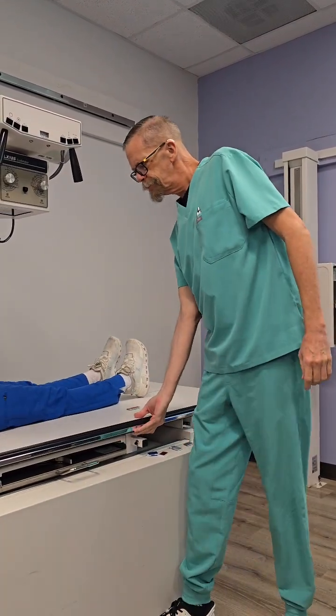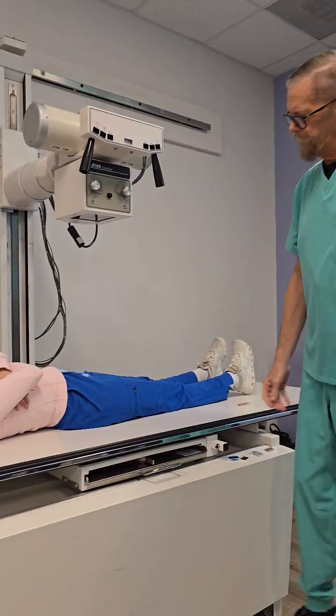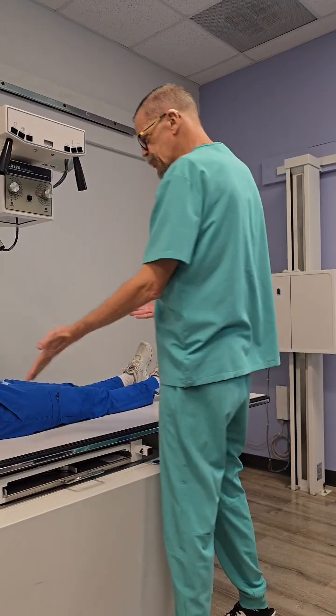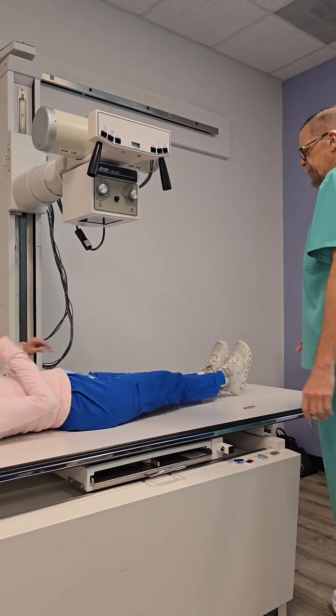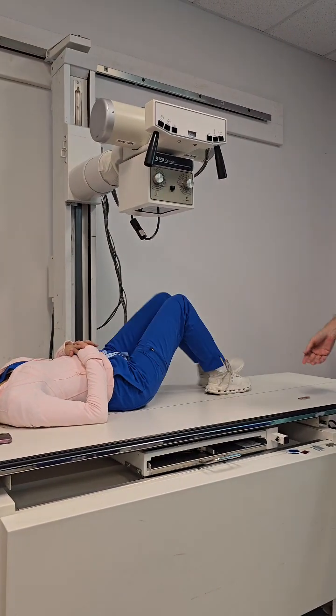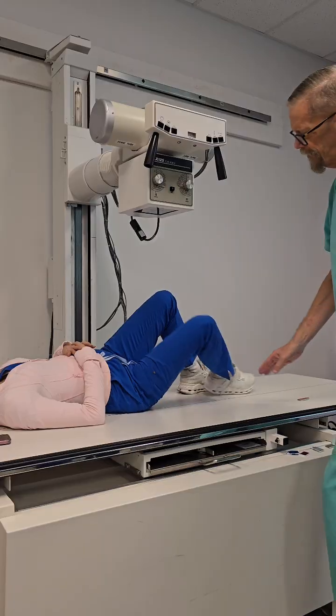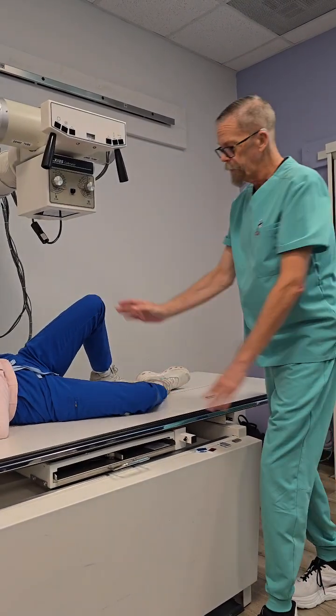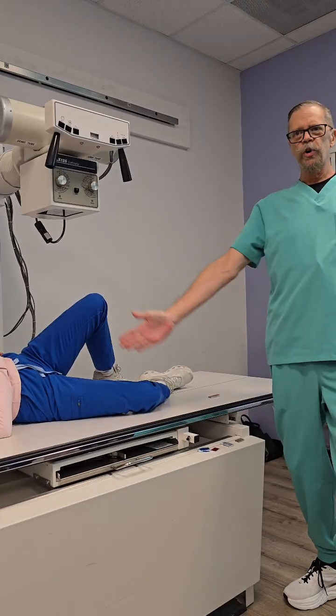Let's go ahead and go back to proximal and try it the way they did on the video. First off, let me have you scoot to your left a little bit to the edge of the table. Go ahead and bend both your knees. Drop this one down. She's pretty good right there. I could bring this other hip over a little bit more, but I don't like where her leg is.